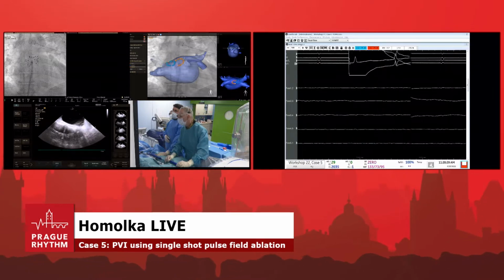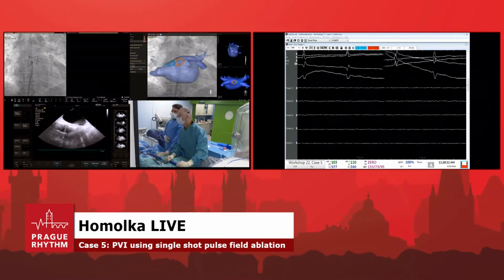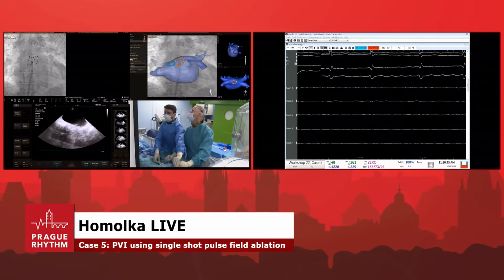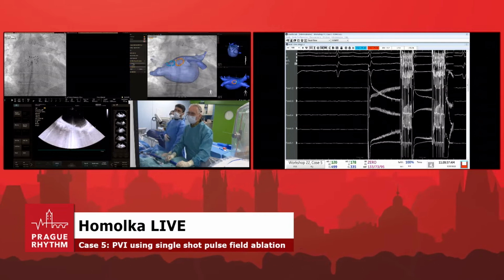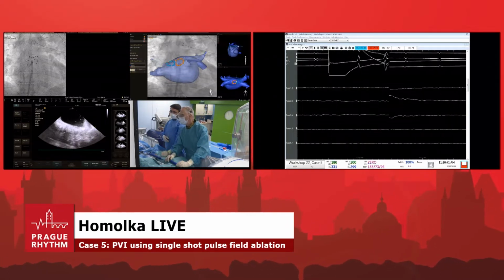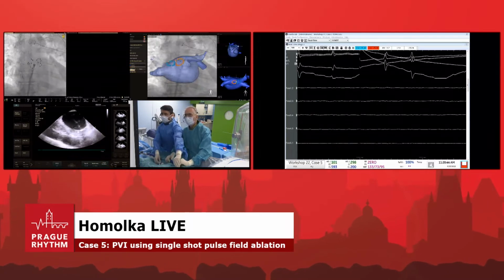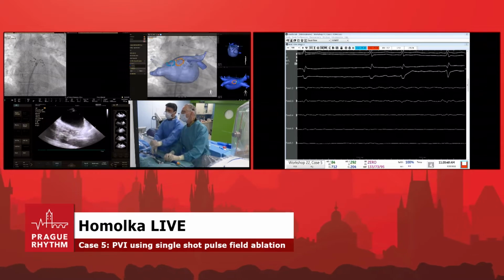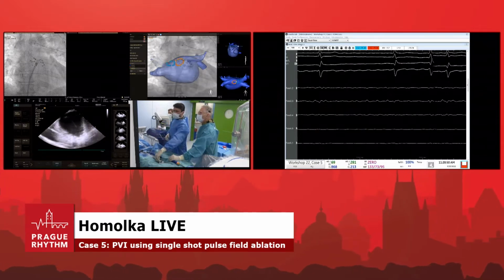Signals are disappearing. Look at the signals. Fantastic. Let's go one more. See, it's completely empty now. So actually, if you wait 1 or 2 minutes, it doesn't matter, because we can just finish the posterior wall. Okay, we give you 2 minutes more. Perfect. Let's go one more here.